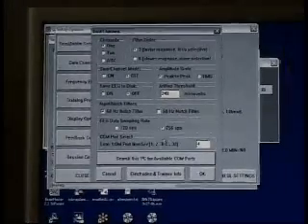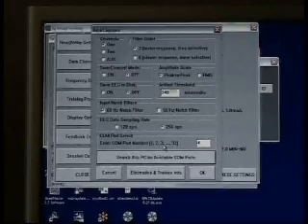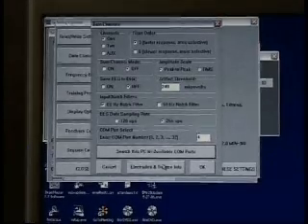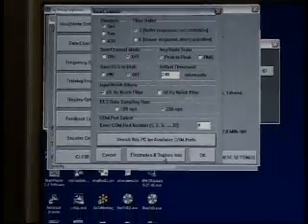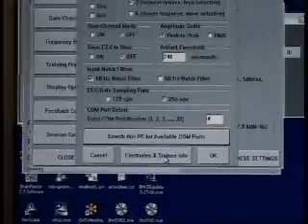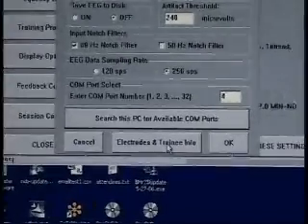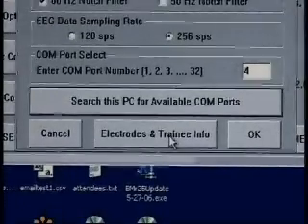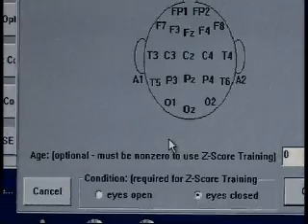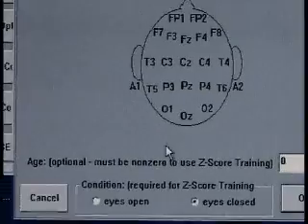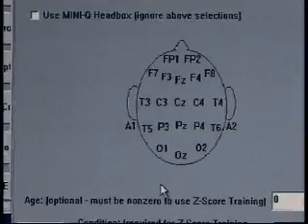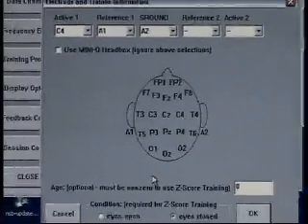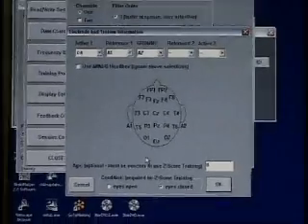Our next step is to scroll down. Right below that PC COM button is an Electrodes and Training Info button. As I click that, we get another box that gives us our electrode identifiers.